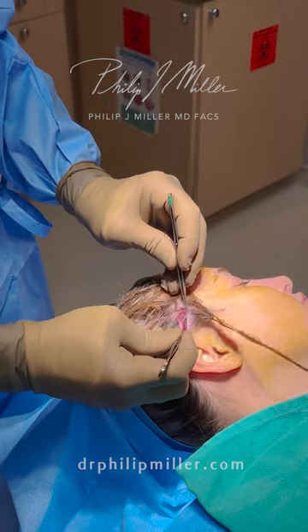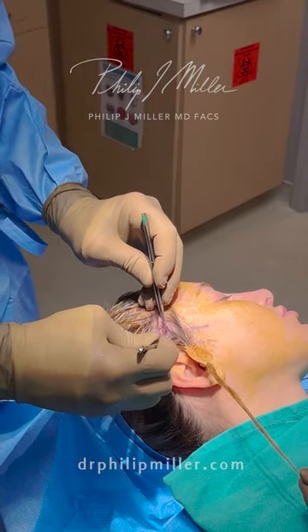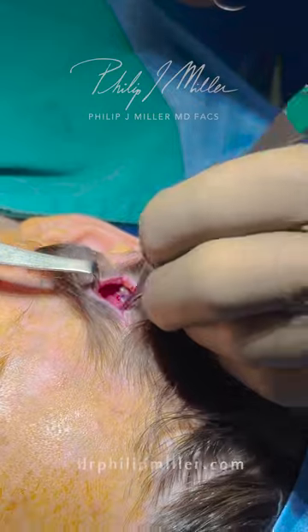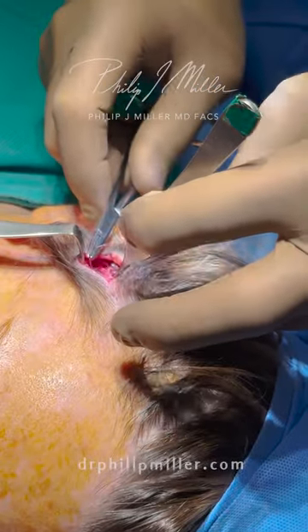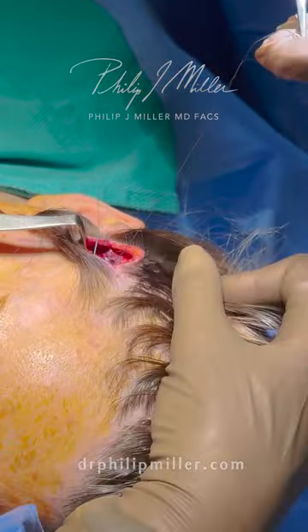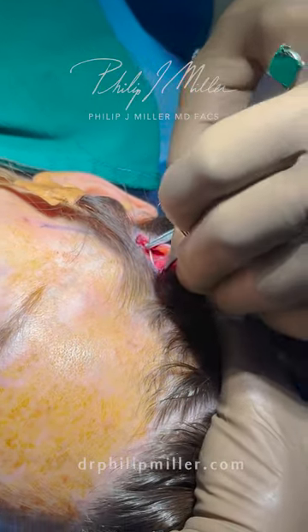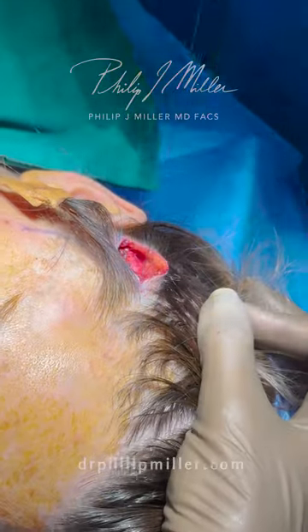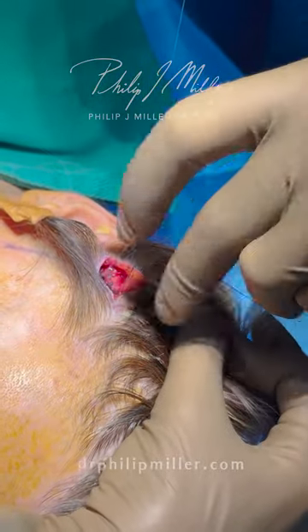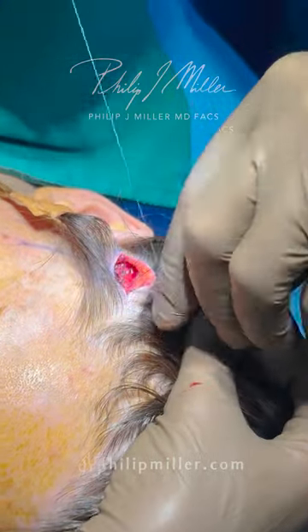After you determine the location for the best movement, you put a mark. Now we're going to grab that tissue and just advance it in a plication fashion. I'm going to grab this superficial layer right here — you can see how it moves. I'm going to grab just the superficial part of it right there and then form a plication, a little bit cephalic to that. Horizontal mattress — in this case the other ones were vertical. This is a 3-0 ethibond. I like it because it slides, it's braided but it slides, and then it fixates very, very well.